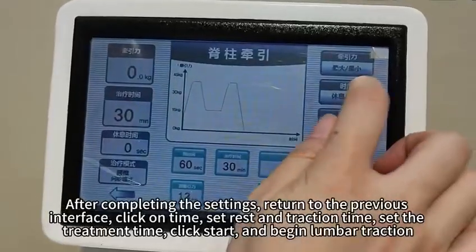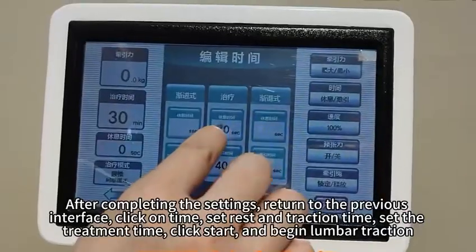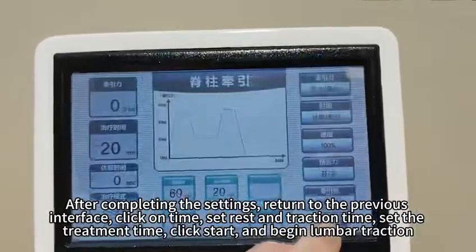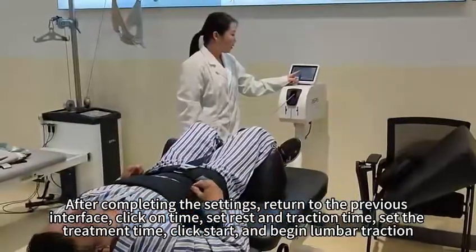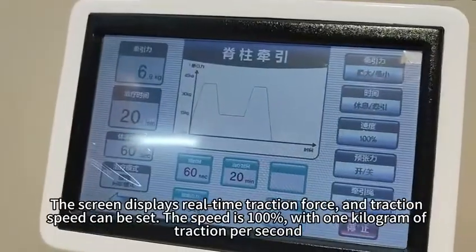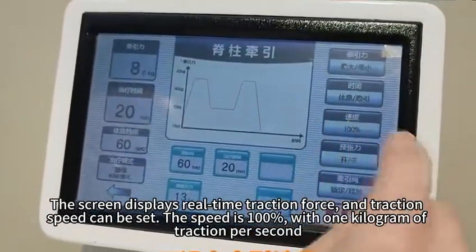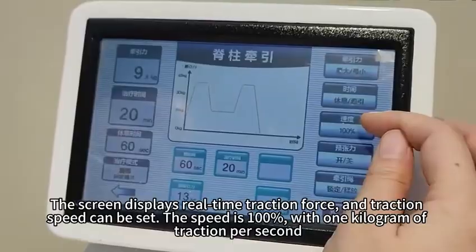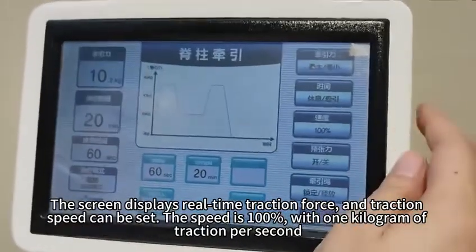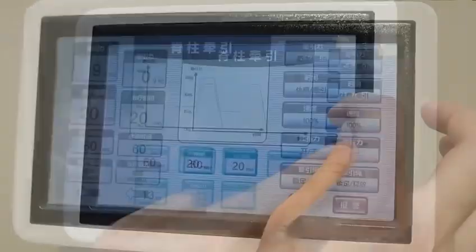After completing the settings, return to the previous interface. Click on Time, set rest and traction time, set the treatment time, click Start, and begin lumbar traction. The screen displays real-time traction force, and traction speed can be set. The speed is 100%, with 1 kilogram of traction per second.